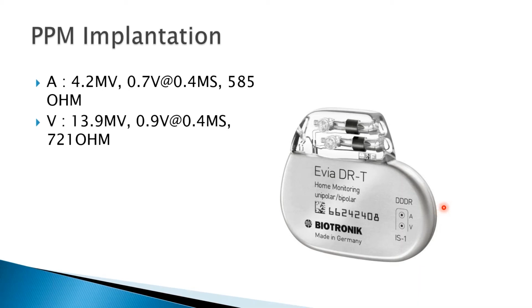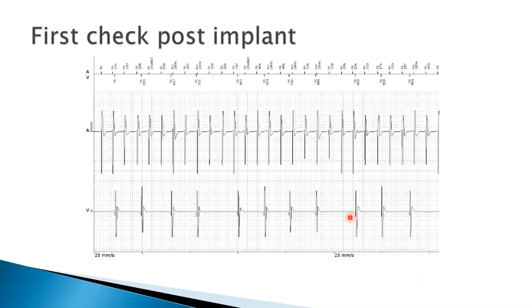And of course, we actually had the opportunity to use the CLS enabled pacemaker, BIOTRONIK. During the first post-implant check, 6 weeks later, this is something that caught us by surprise. If you look here, the upper tracing is from the atrial electrogram, from the atrial leads. The lower tracing is from the ventricular leads itself. And you do see that despite the V signals being very irregular, the A signals are very constant.